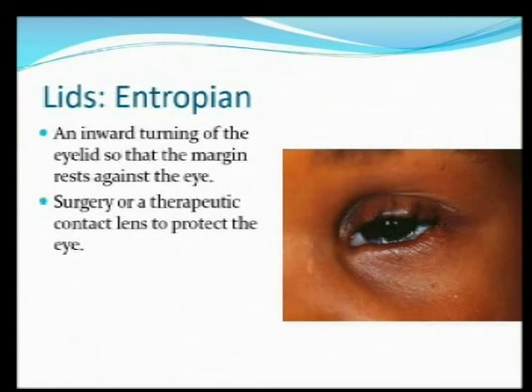You can all appreciate what it's like to get a one eyelash in your eye. Can you imagine all of your eyelashes in your eye? Very, very uncomfortable. So one of the things that will bring these people instant relief is fitting them with a therapeutic contact lens, typically just a non-prescription or prescription soft lens that's placed on there to provide a barrier between the eye and the lashes.